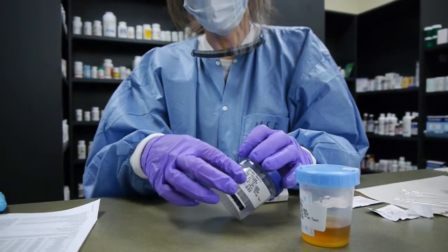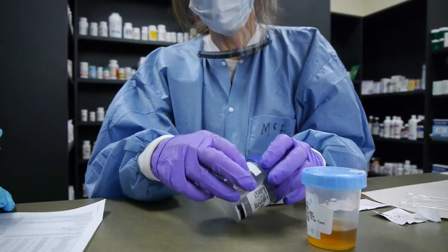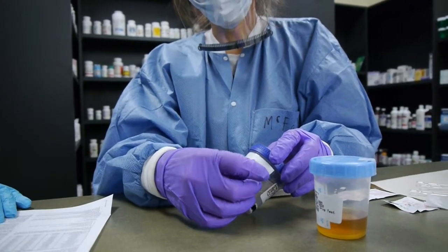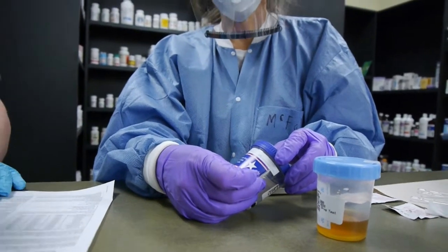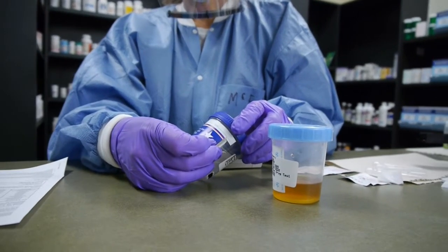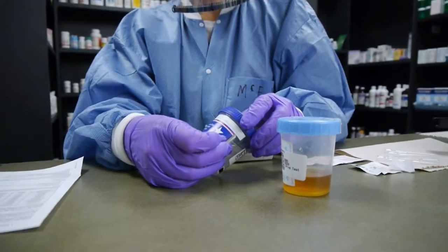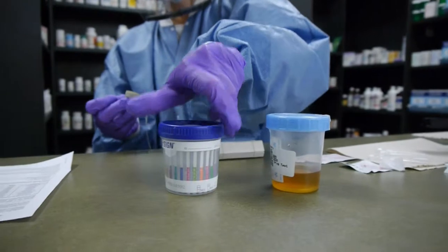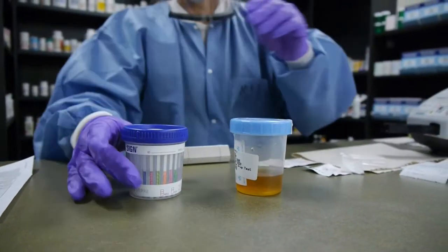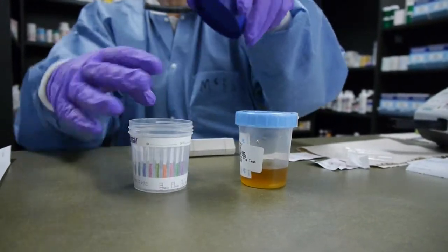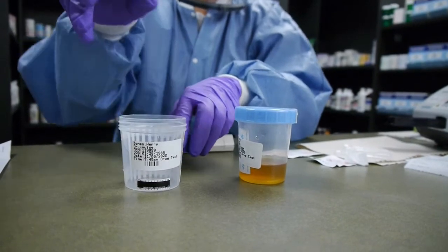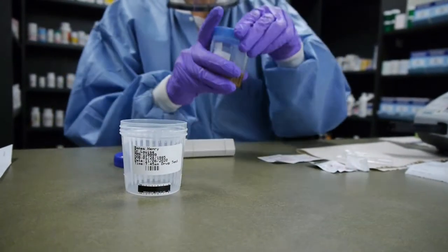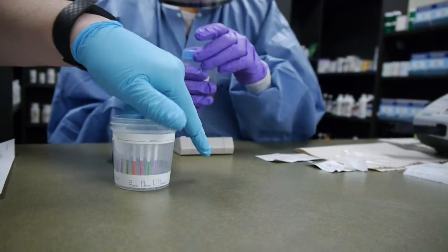In the real world we would do this with patients that have just given us a urine sample, so it would be nice and warm. Go ahead and take off that strip. This particular kit gives us I think 11 different tests of drugs.